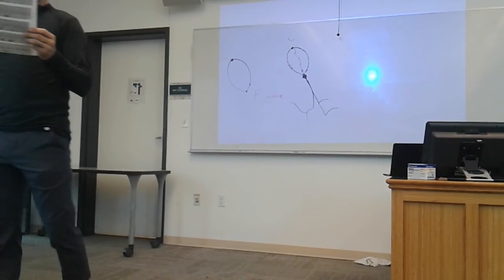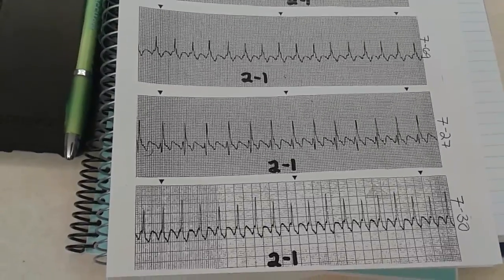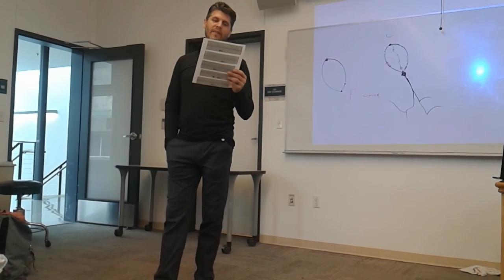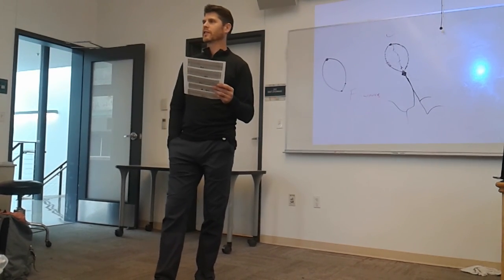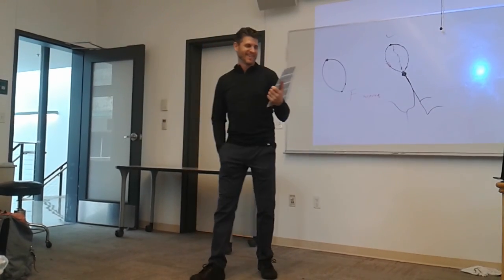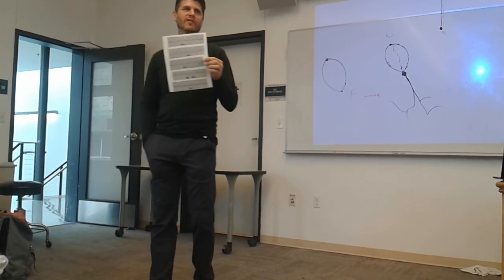So that means you'll see a large F wave how often? Every big box. So if you start seeing what looks like a P wave every big box, that's your first clue. Then you look and there's no baseline. That's your second clue. And most of them will have a characteristic sawtooth pattern, looking like the teeth of a saw. That's where you'll start to see those patterns put together and you name it a flutter.